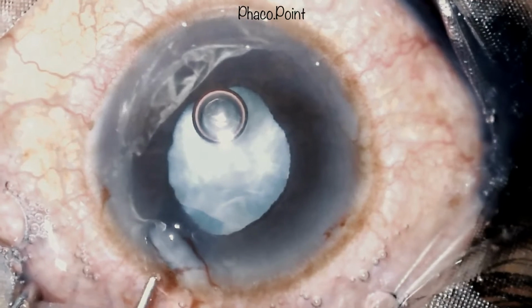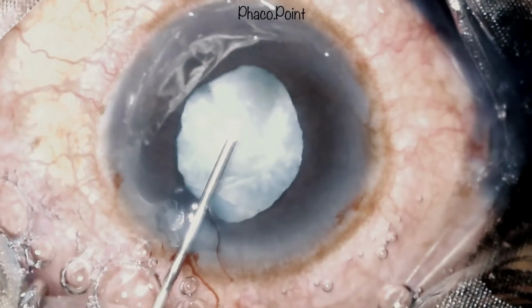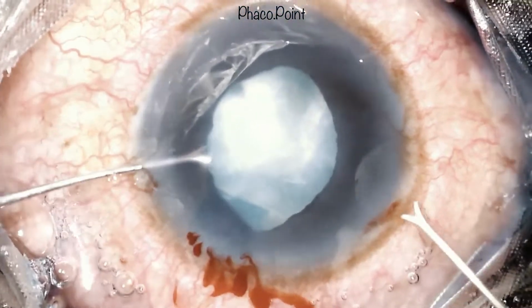A cohesive viscoelastic is then introduced into the anterior chamber. All the excessive air bubbles are removed by pressing on the posterior lip of the limbus. This allows for maintaining adequate space to work in this extremely shallow anterior chamber. Moreover, it is useful in performing the rhexis in an intumescent cataract.